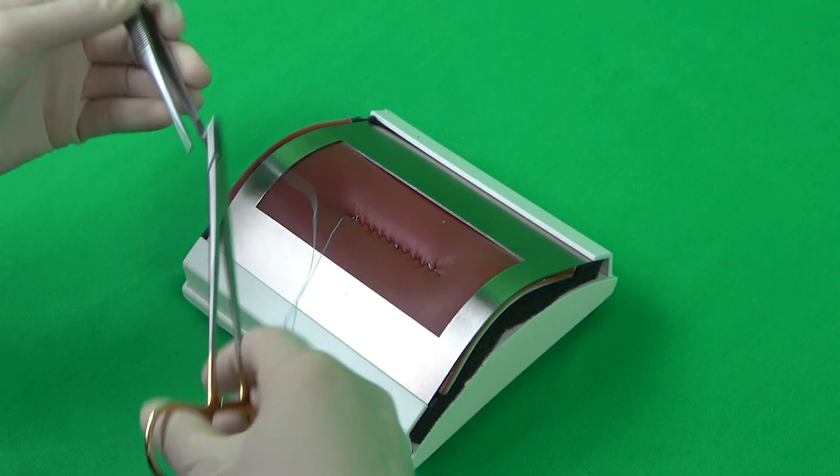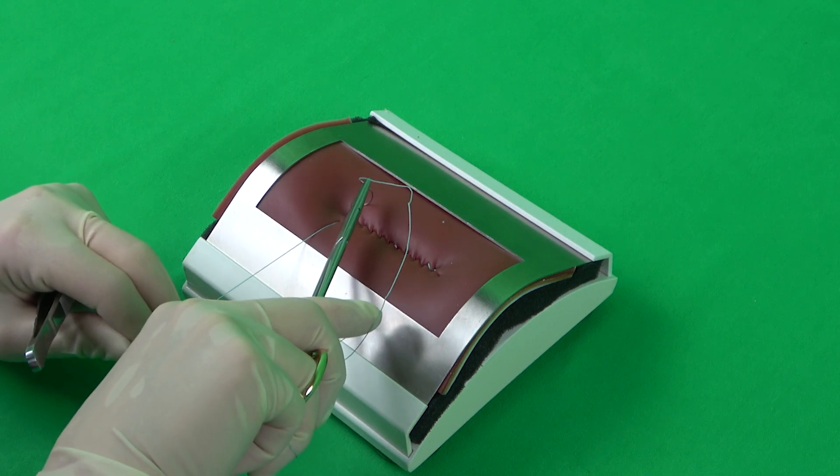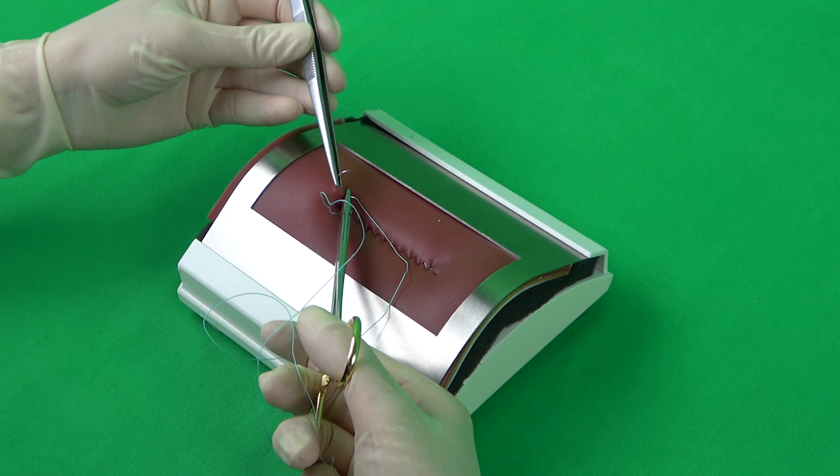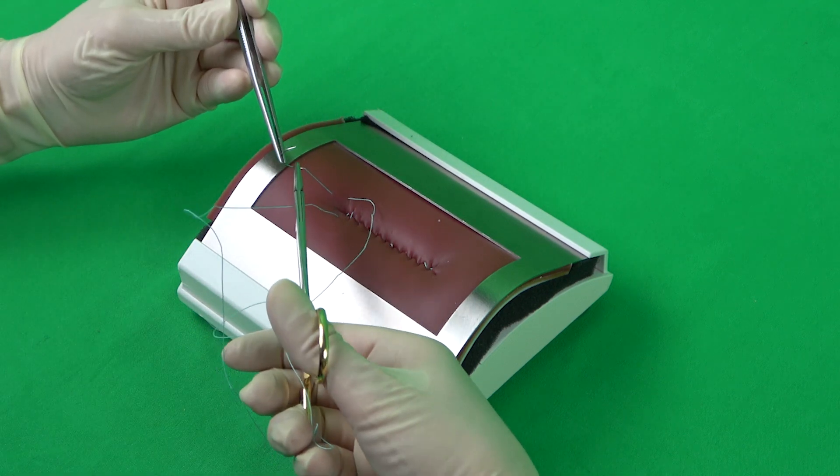The suture is once again finished with a V-shaped perforation outside of the wound gap. While tightening the suture, it is important to leave a loop after the first stitch, as this will be required for the closing of the knot.